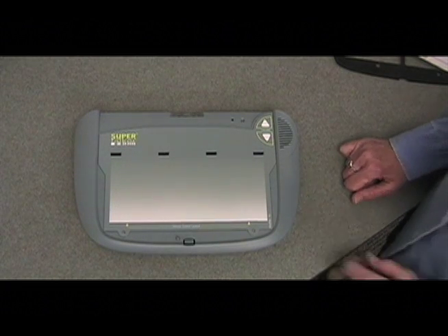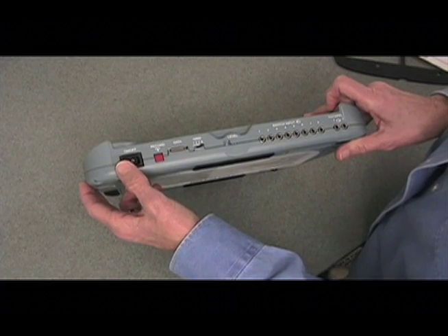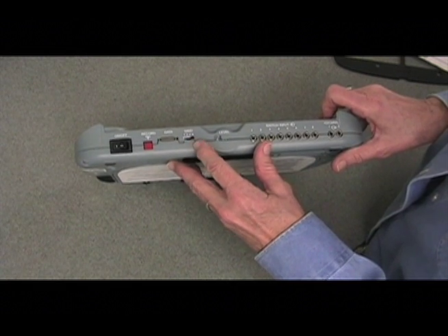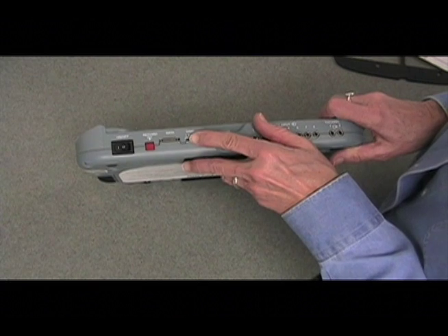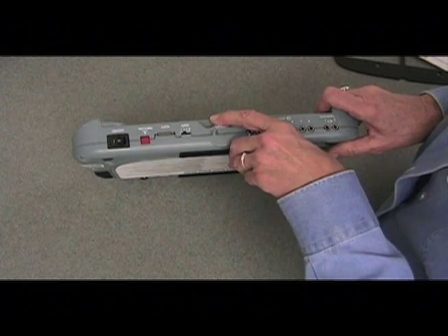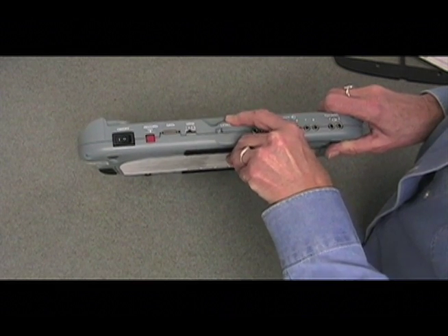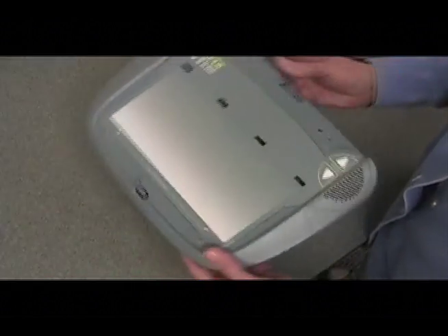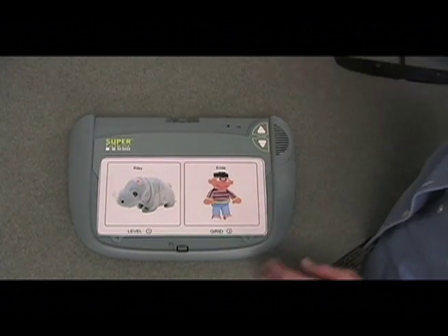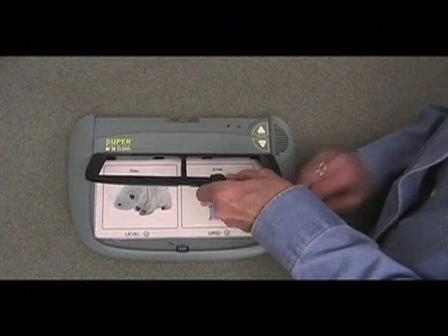Let's record some messages on our SuperTalker. First thing we do is make sure the device is on, and we need to make sure that our grid corresponds with the grid we're going to use for our messages. In this case we're going to use grid 2, so I move my grid selector to 2, and we're going to record on level 2, so I'm going to move my level selector to number 2. Now we're ready to put the grid and the overlay in place. Again, this overlay was made with BoardMaker and with some digital pictures that I downloaded. Snap the grid on.